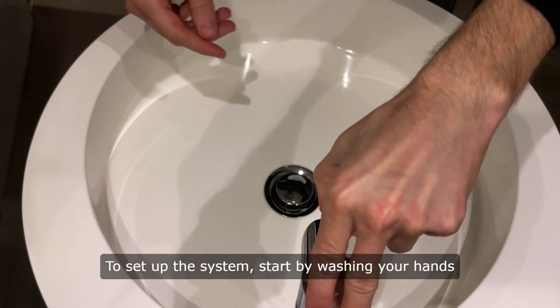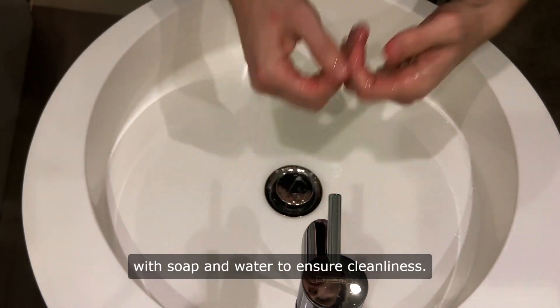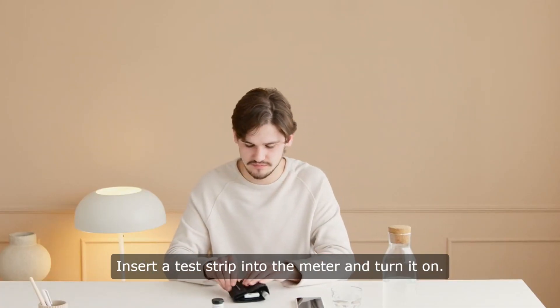To set up the system, start by washing your hands with soap and water to ensure cleanliness. Insert a test strip into the meter and turn it on.